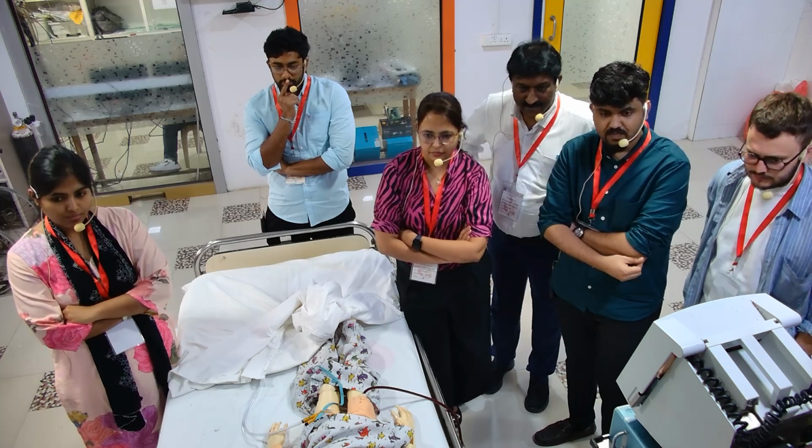So the first thing you noticed was flows. With the same RPM, the flow decreased. Okay, that is the first thing you noticed. Second, pressures. P1 pressure became more negative. You said negative clearly, isn't it? Okay, so now it was very clear that there is something wrong in the venous drainage line. That was very clear.